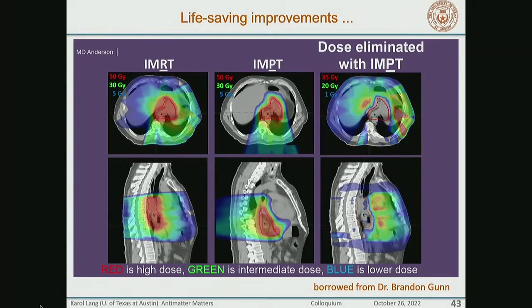So this is a simulation of a particular irradiation, if I were using gammas, or X-rays, or if I were using protons. It's a very different image, and this shows where you would be depositing energy if you were using gammas, which is where it is not necessary. So this is directly damaging tissues that you don't want to damage.